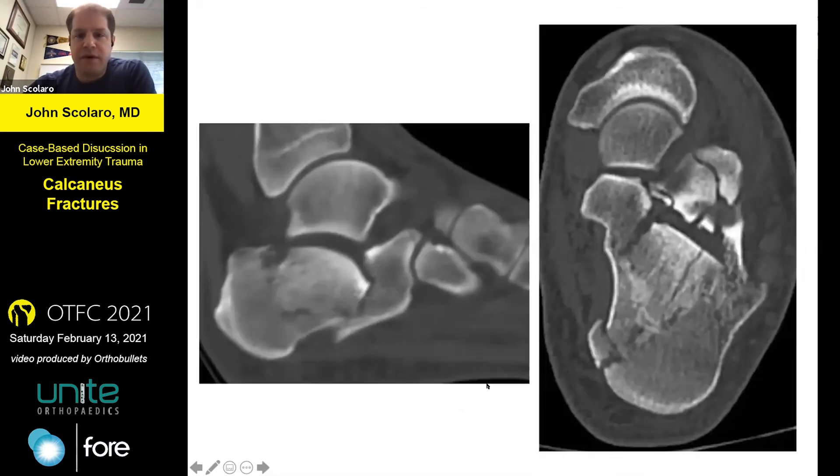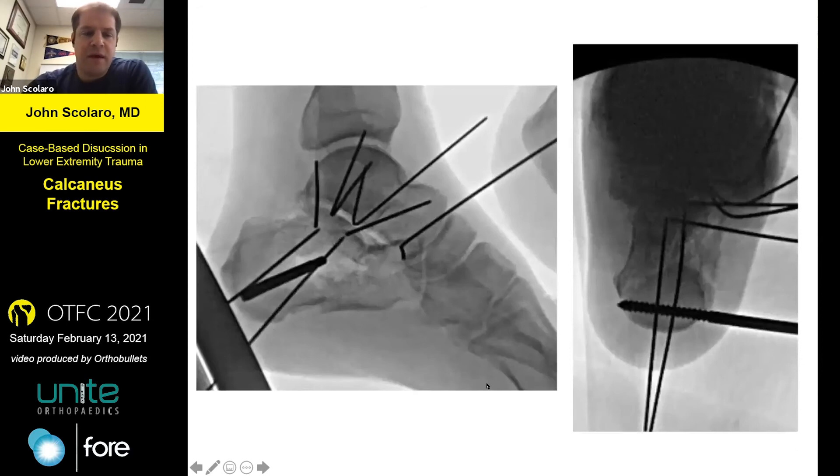I wanted to show very quickly that the lateral extensile is still a very powerful approach when done carefully and correctly — coming in and leaving in a very respectful manner. The partially threaded Schanz pin in the tuber is one of the most powerful parts of this. You can see the bent Kirschner wires placed and then bent with a Frasier tip sucker to allow a no-touch technique, and then restoration of the critical angle with good axial heel views to make sure the tuber is lined up.